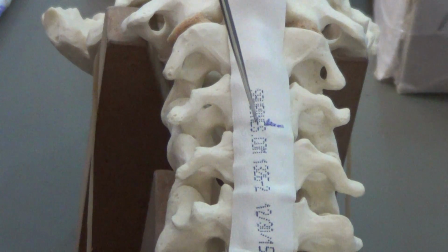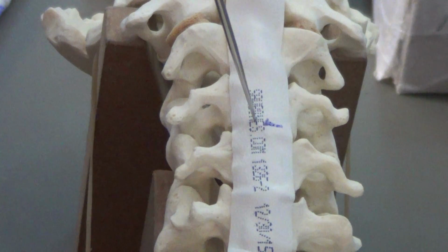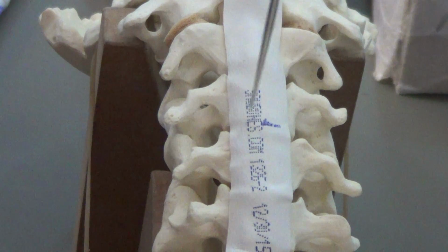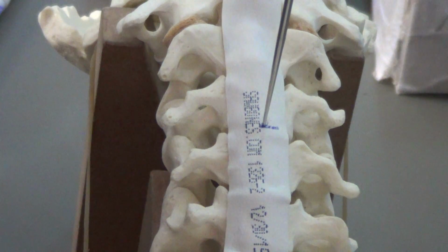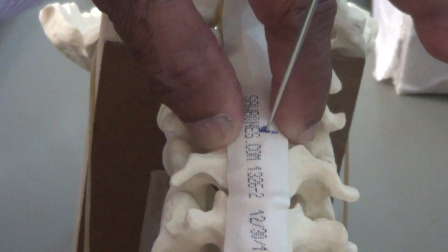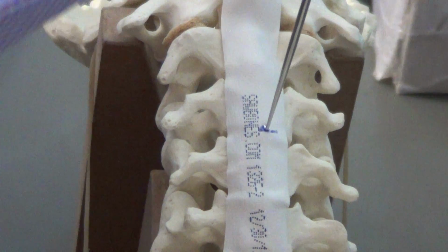Now even then, you should be careful. You should not just rely on the pre-operative imaging and on your marks. You should identify that this is the proper disc space. But usually what they do, you can either put a needle in the disc that is to be excised and then confirm it with a lateral x-ray. Once you have identified that this is the disc, definitely you have to do an imaging, lateral x-ray, and confirm that this is the disc.